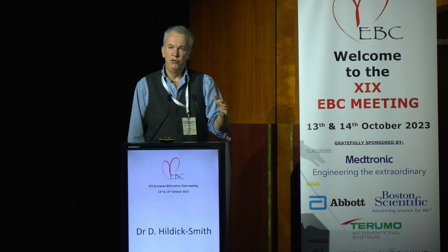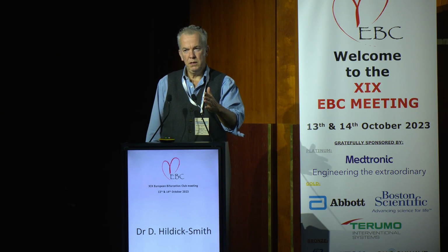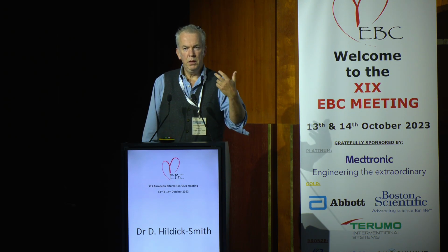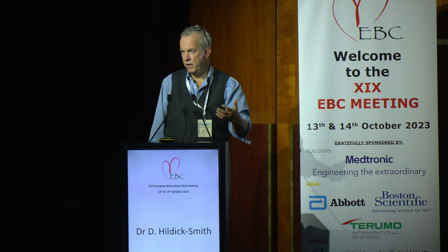In the drug-coated balloon group, it would be main side, side main. So having prepared the main vessel, the side vessel would then be prepared with simple balloon, then a drug-coated balloon, and then you'd come back to drug-coated balloon in the main vessel.